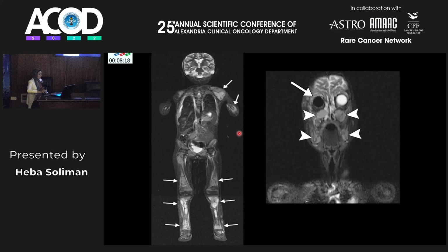This is a case of surgically managed retinoblastoma, but unfortunately he developed widespread osseous metastasis involving the appendicular skeleton and the facial bones. And it is very evident on the coronal STIR image of whole body MRI.